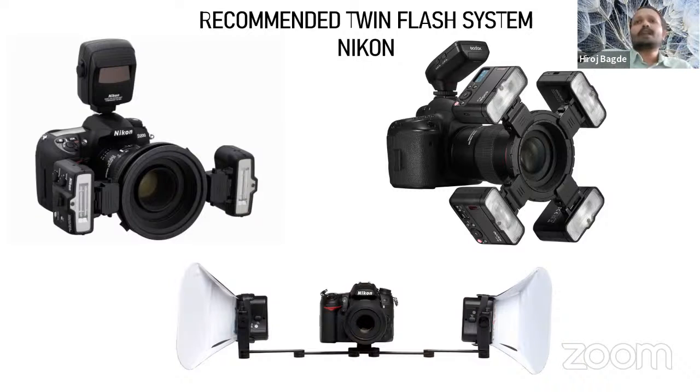In such cases, you need to start recording first. Cases have to be started, whether you go for a twin flash system or a ring flash system. My main purpose when I teach dental photography or dental recordings is for you to please start recording your cases, so that it is good for you, for the patient, for medico-legal purposes, and for publishing in various articles.